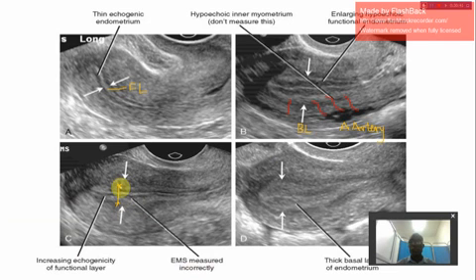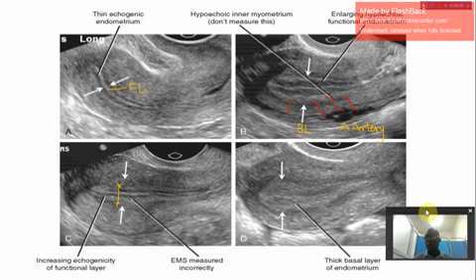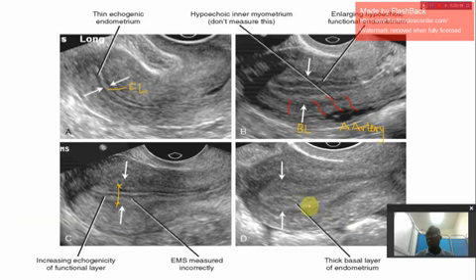Okay, so these are all sonographic phenomena of the endometrium. This is the basal layer of the endometrium. So this endometrium measurement is fake. You measure from here to here. So that's how to measure. You always measure the thicker part of the endometrium.